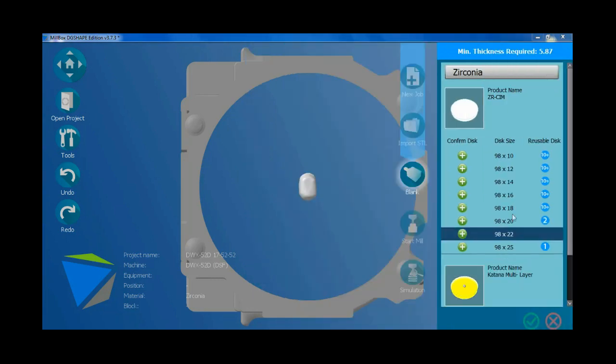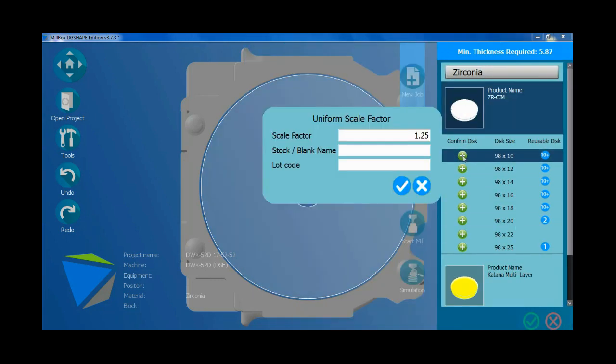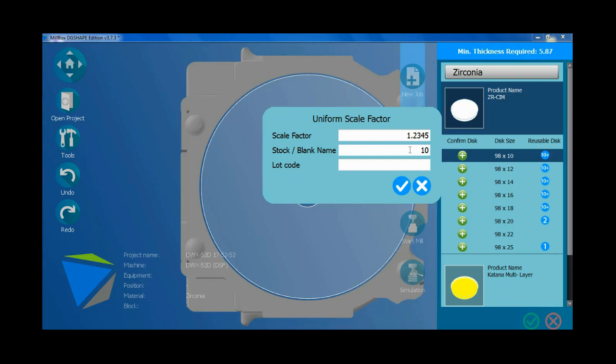If you need to start with a new blank, click on plus. In this window insert the scale factor written on the blank or its box. Choose a name for the blank. The lot code is optional. Click on check box.